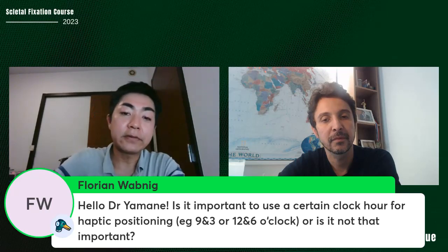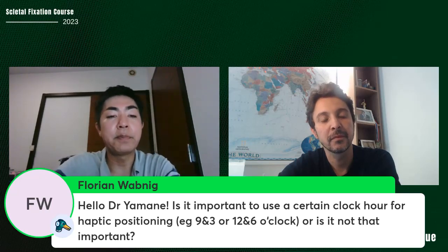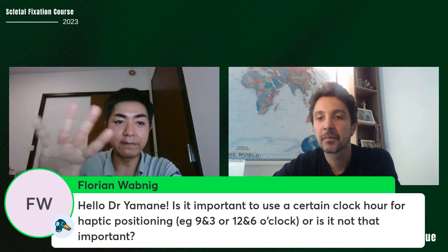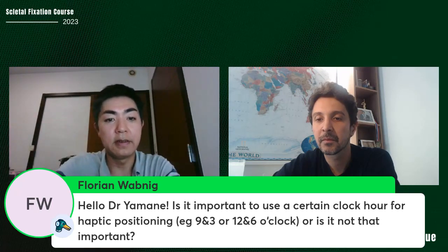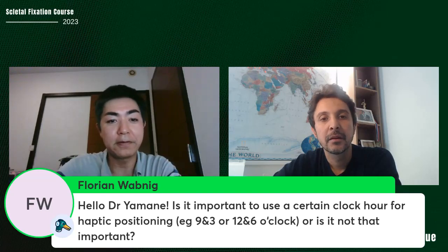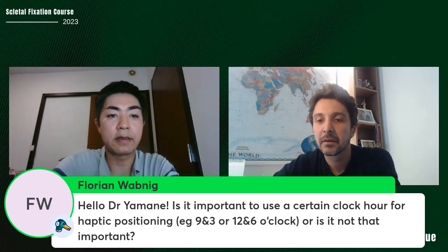The position is not so important, I think. The positional relationship of the wounds is very important, but you can rotate to any position. I think 9-3, 4-10, any position is okay.